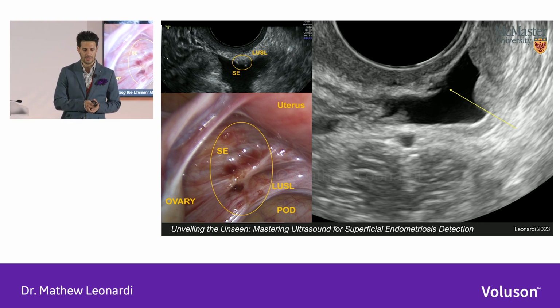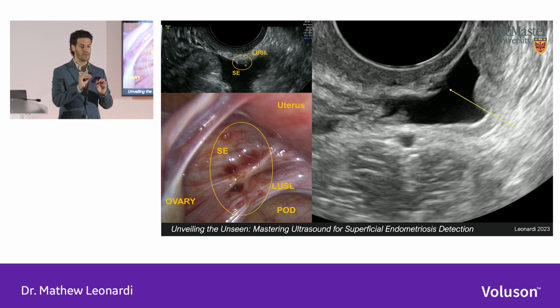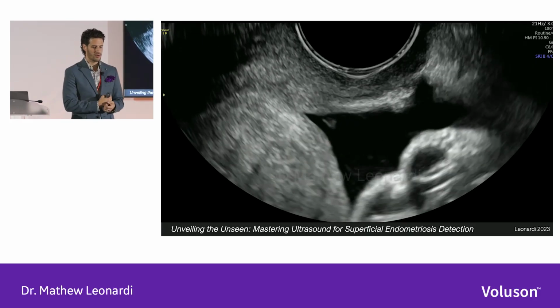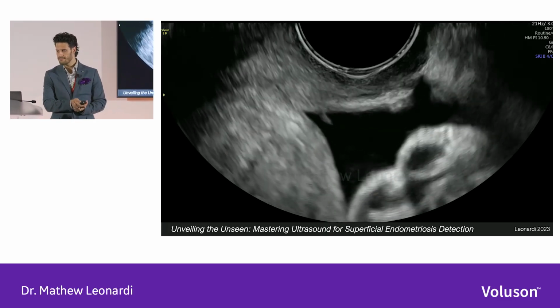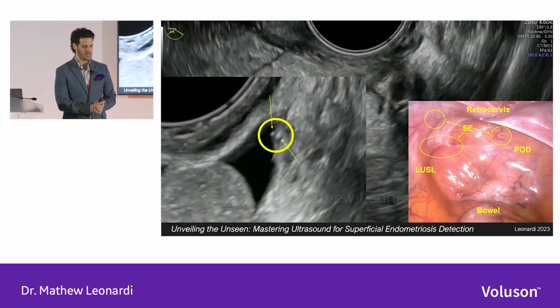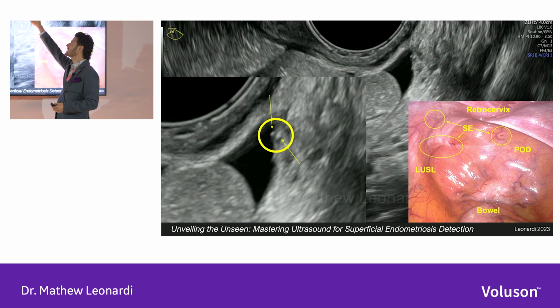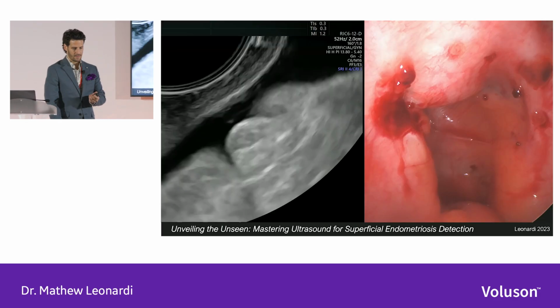So these are a few more depictions of superficial endometriosis. Here's a combination nodule of hypoechoic irregularity with hyperechoic foci. Here's what it can look like at surgery. Here's another jiggle test overlying the back of the uterosacral ligament, a little bit more medial towards the vagina. This one's a really subtle one, but I've zoomed it up for you. So look in the smaller version, the video version as well, just up here. Teeny tiny. All you need is a sliver of fluid to be able to see this.